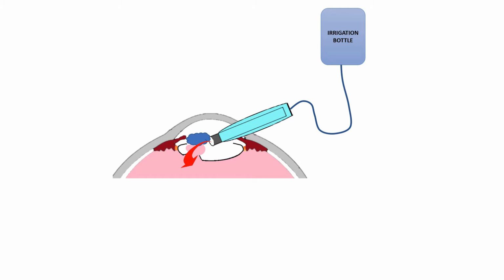This hydrated vitreous causes stress on the ruptured posterior capsule and within seconds increases the size of the opening. Before you realize it, you have a PCR much larger than the original size when first detected. Now once OVD is put in, the vitreous in the posterior segment gets plugged, but already a significant amount of vitreous is in the anterior segment and the rent is quite large.